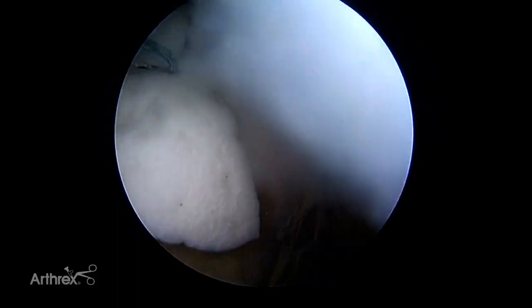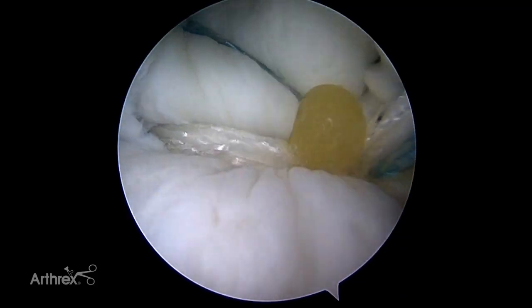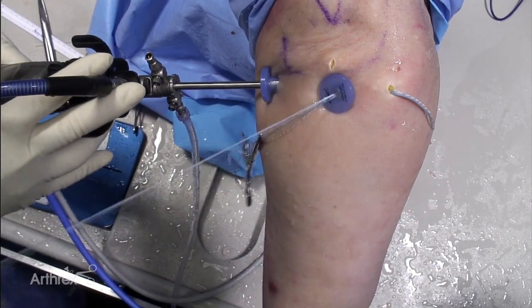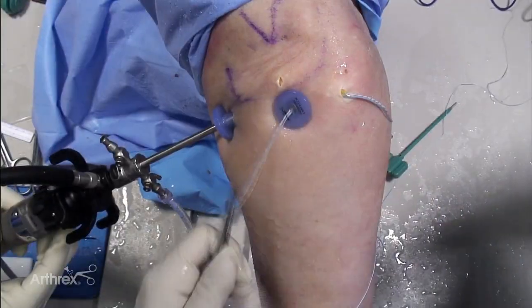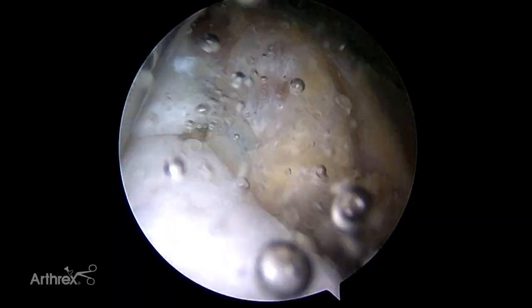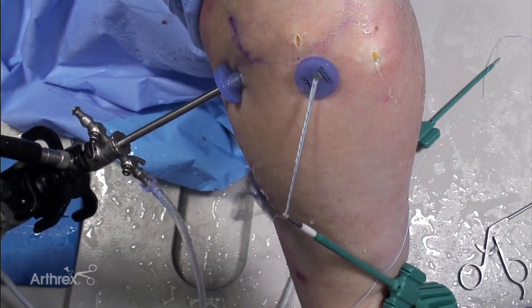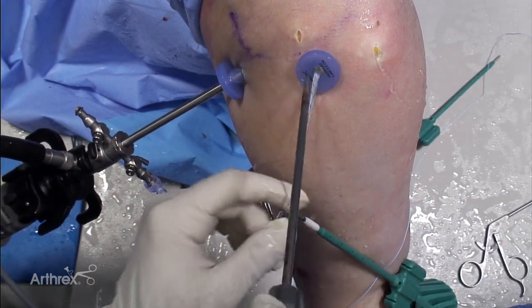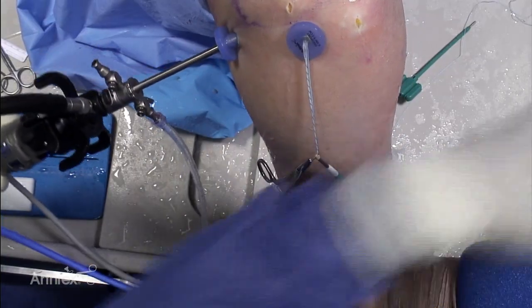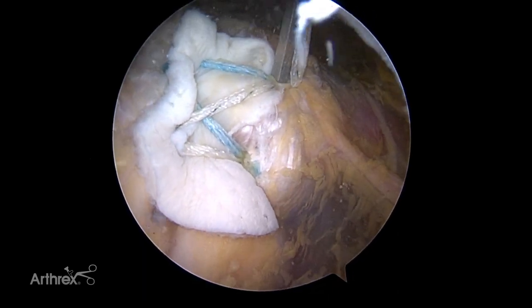Tension the fiber tapes before placing the eyelet in the hole. Do not attempt to apply tension with the eyelet in the bone socket. If it is determined that the tension is not adequate, the driver can be backed out and tension readjusted. Insert the cannulated vented biocomposite swivel lock anchor. The two remaining fiber tape tails are loaded into a second lateral swivel lock anchor, tensioned exactly as described for the first lateral anchor and secured by the anchor body.